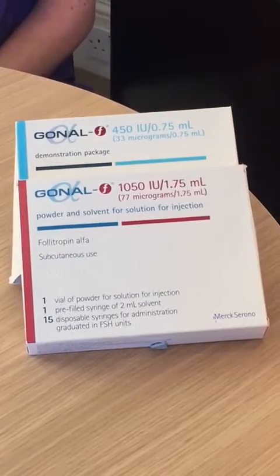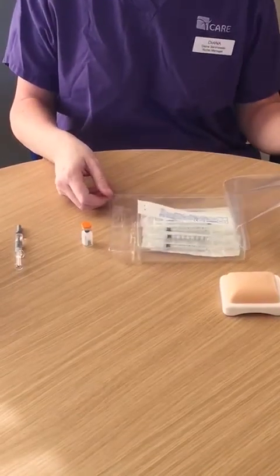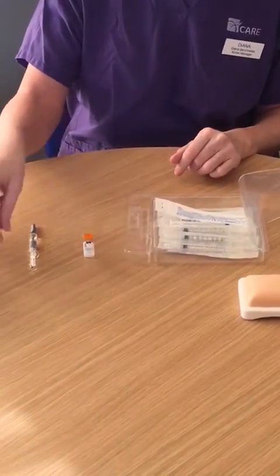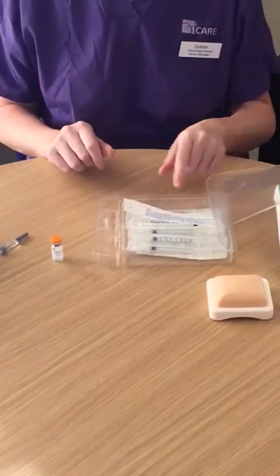I'm going to show you how to prepare and administer Gonal-F multi-dose vials. Remove your pack from the box and open your pack. Inside your pack you will have a vial with powder, a syringe with some solvent solution in, and some needles for administration.